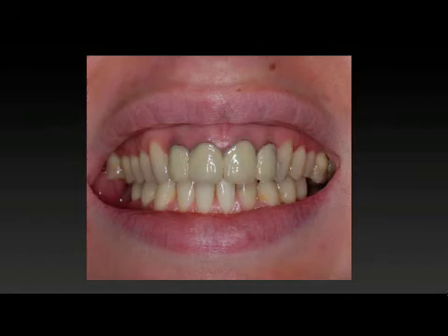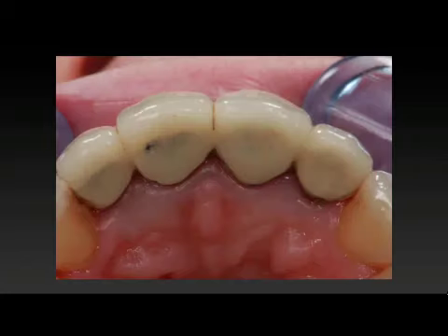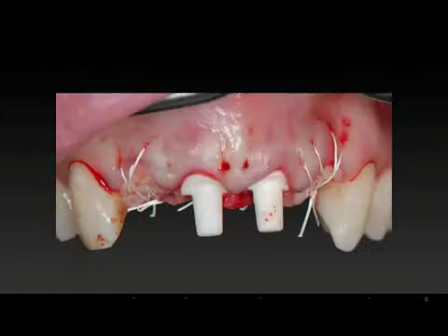This case is, again, going back to endodontic failure of these 4 incisors. This lady came in complaining about the dark margins around these PFM crowns with definite oxidation damage. So the tissue is inflamed, the tissue is almost purple. Part of it is inflammation, part of it is the color of these actual roots. And everything was obviously splintered together, so we couldn't clean, decay, what have you, with failures.